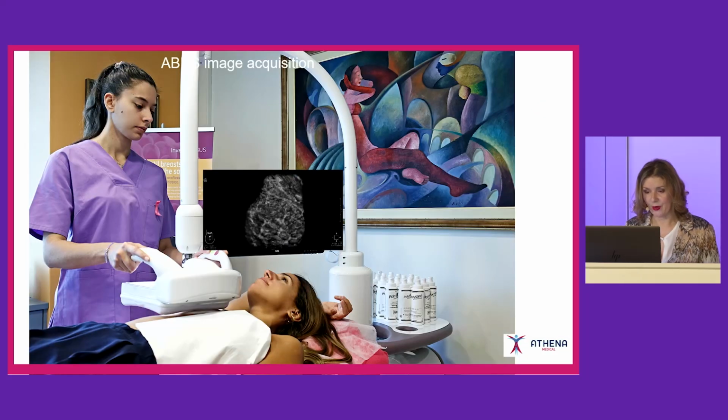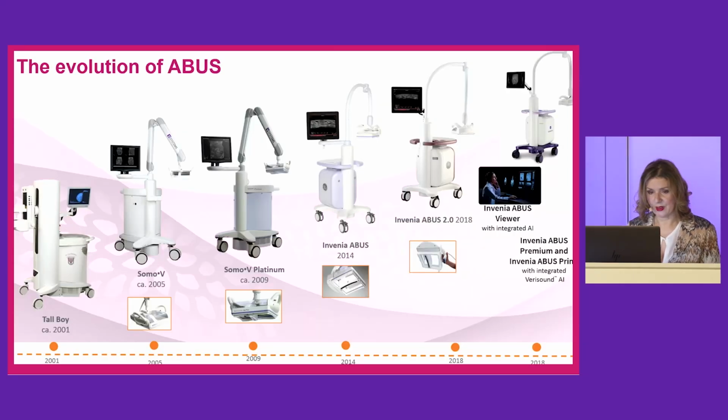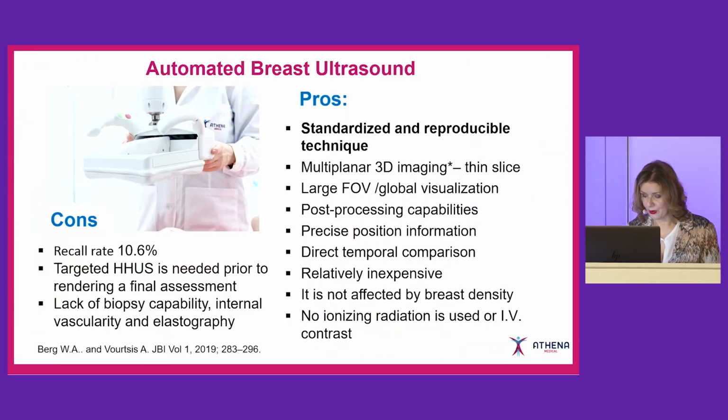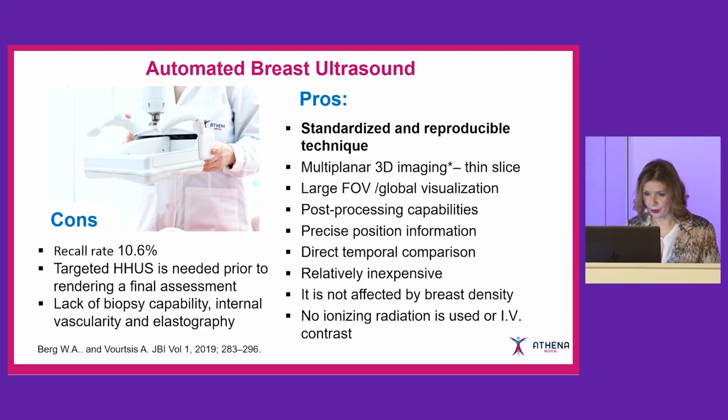This is how our ABUS room looks. You can see the woman is in the supine position. The scanning is performed with a large transducer. Here is the evolution of ABUS. We integrated our ABUS back in 2017, at the beginning of January of that year. So we have about 8 years of experience. Then we went on with Invenia ABUS 2.0, and now we have worked for about 3 months with the premium Invenia unit, and we'll talk about it more.